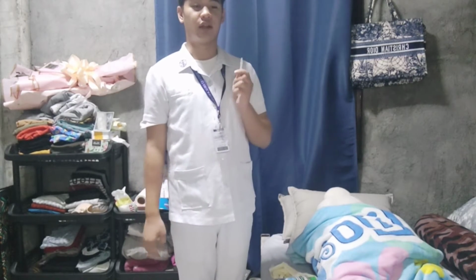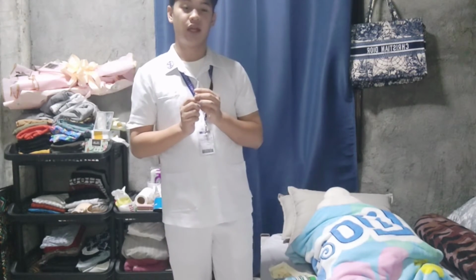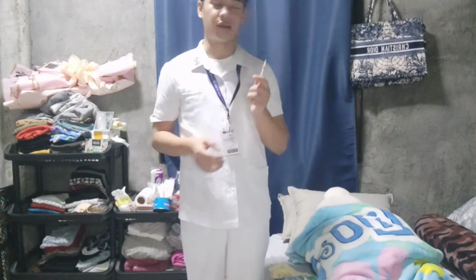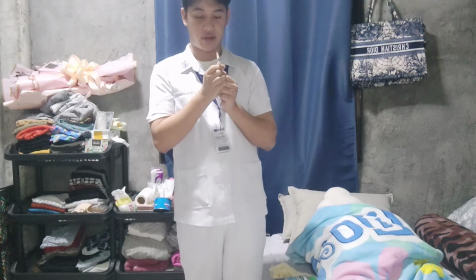Next, remove the cap from the needle, then draw up into the syringe an amount of air equal to the volume of the medication to be withdrawn. The rationale is to make sure that there are no bubbles when the medication is being drawn. I'm going to use 0.1 cc or units.